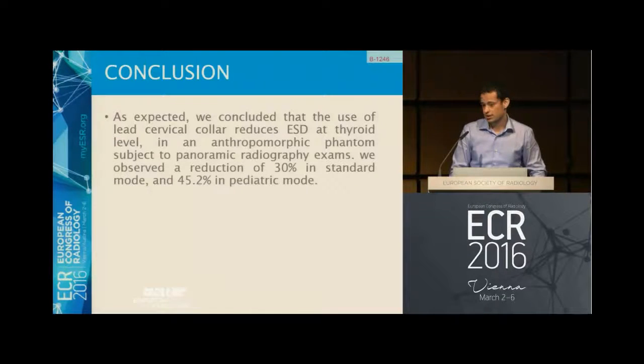As we expected in our primary hypothesis, the use of a lead cervical collar reduces the ESD at the thyroid level in this type of exam, and we observed a reduction of 30 in the standard mode and almost half in the pediatric exam.